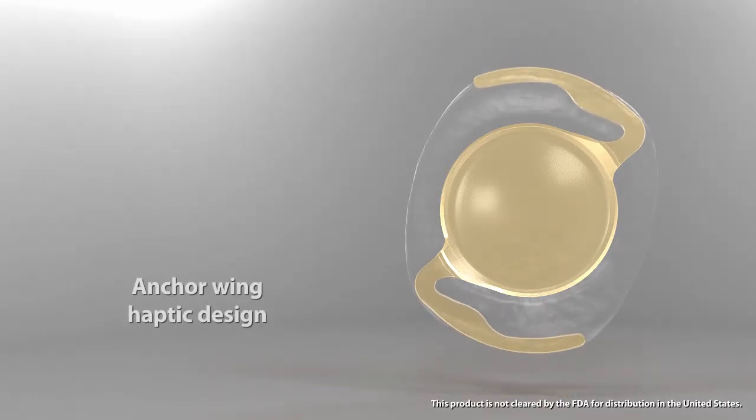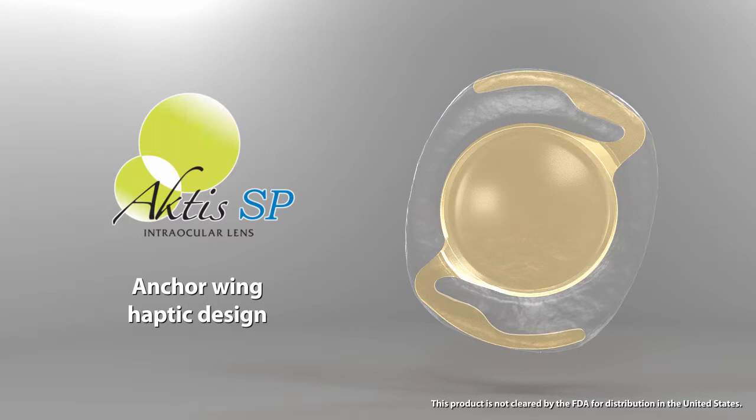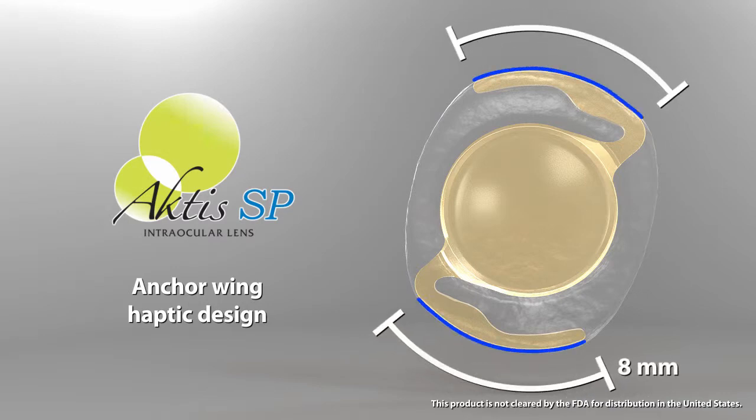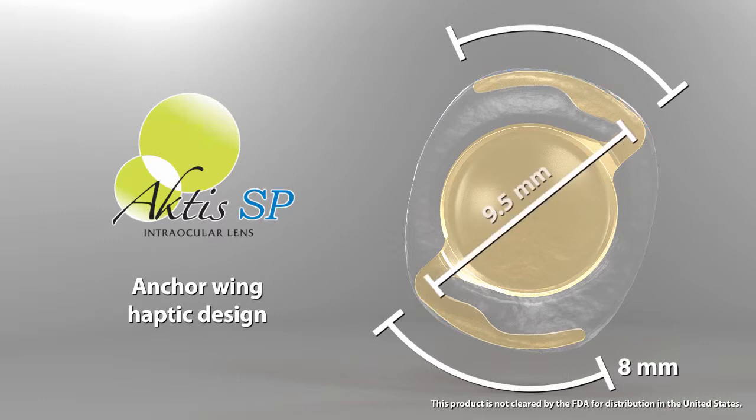The anchor wing haptic design is unique to the Actis SP. An arc length of over 8 millimeters enables a wider contact area between the IOL haptic and the capsular bag. The distance between the haptic shoulders is 9.5 millimeters, which enables stable fixation and avoids IOL decentration or tilting.